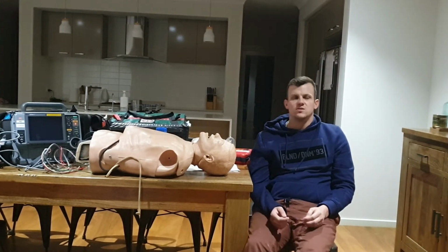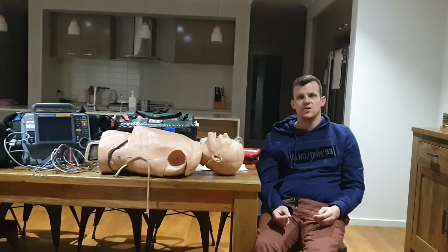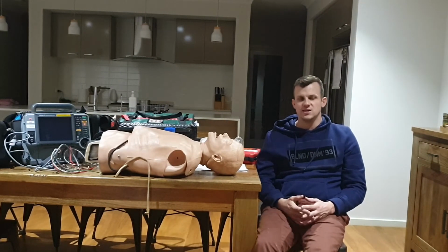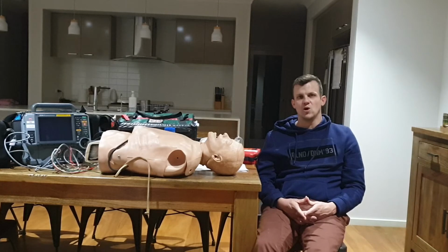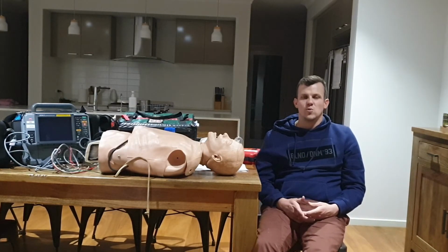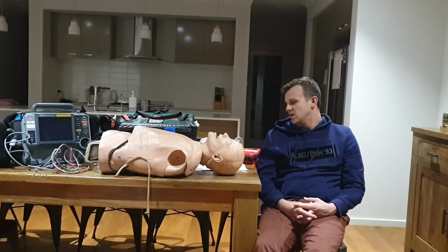There are a few safety considerations. If the patient has a pacemaker previously inserted, you want to apply the pads at least 12 centimeters away from it, as the shock can disrupt the settings of the pacemaker and cause damage to the pacemaker itself or the wires. If sedating the patient, caution should be taken about aspiration of the stomach contents. If it's appropriate, you may be able to insert a nasogastric tube.